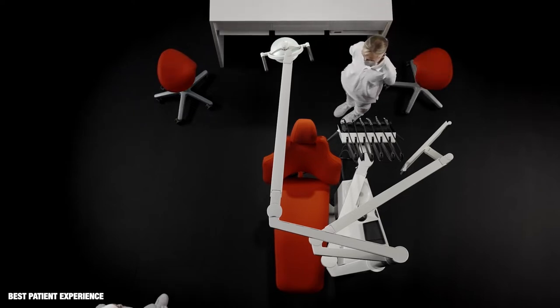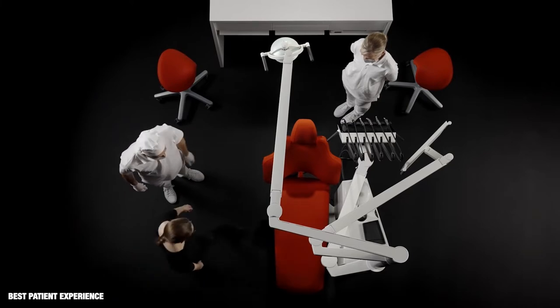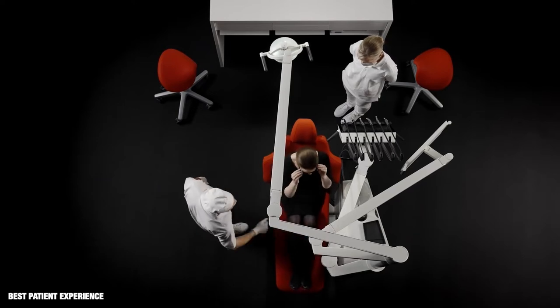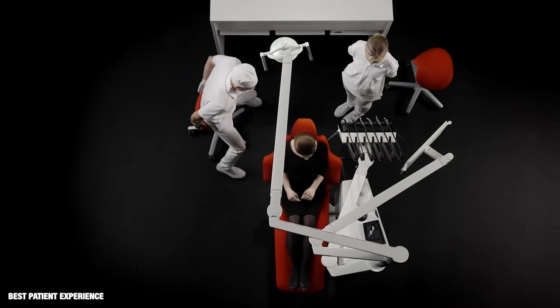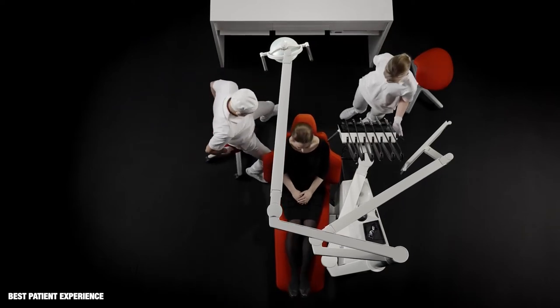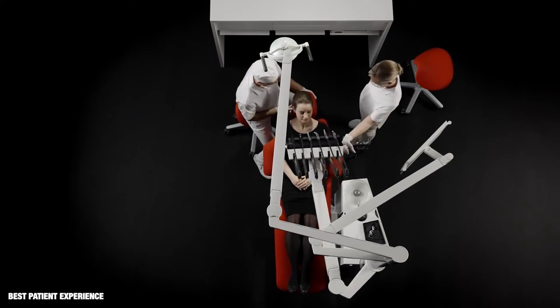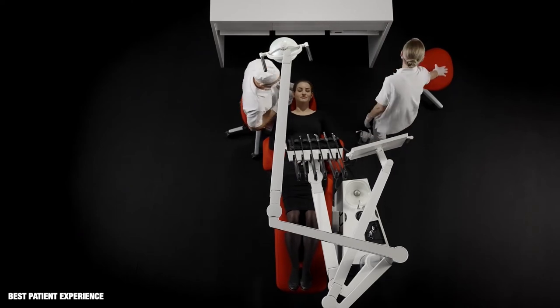With the instrument bridge in the parking position, the patient has free access to the chair. Silent electric motors quickly position the patient in the working position, after which the instrument bridge is placed over the patient's chest.